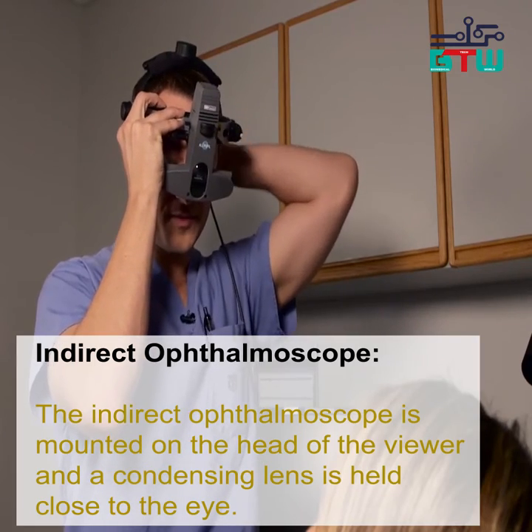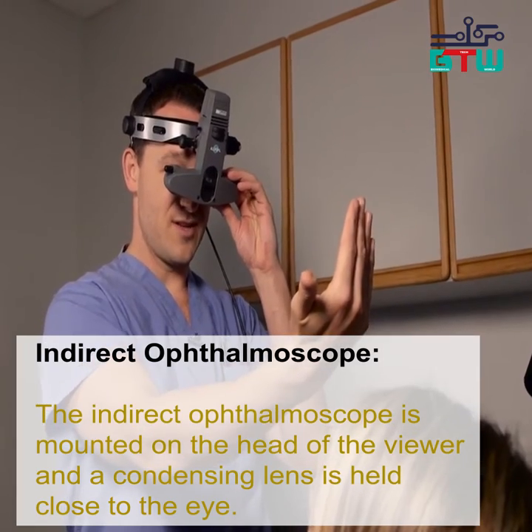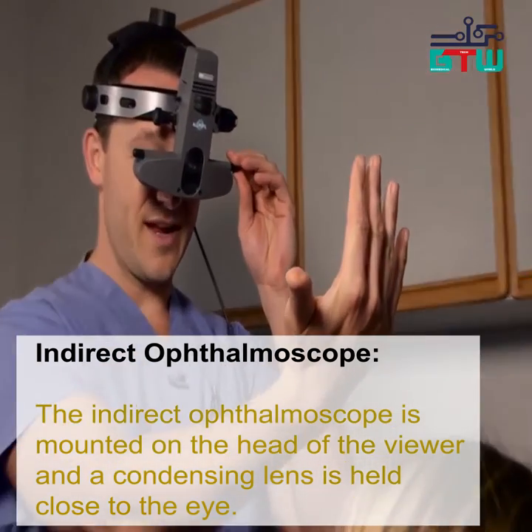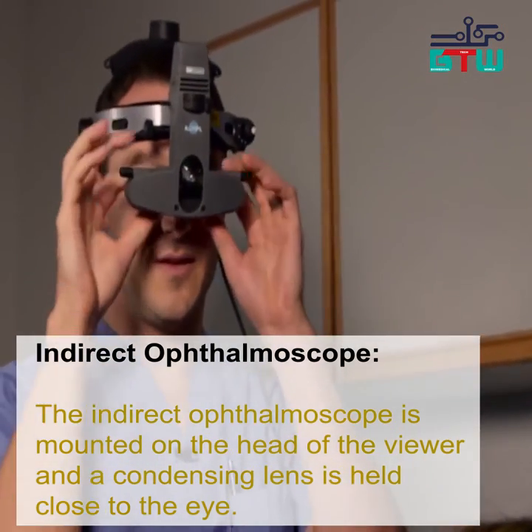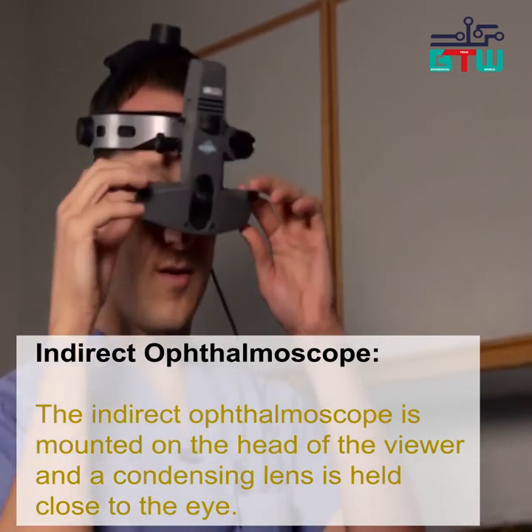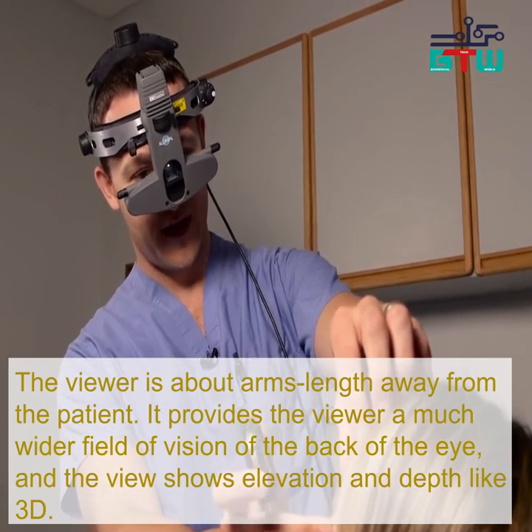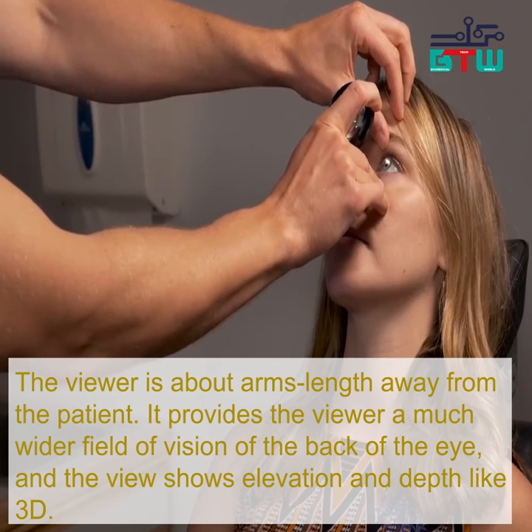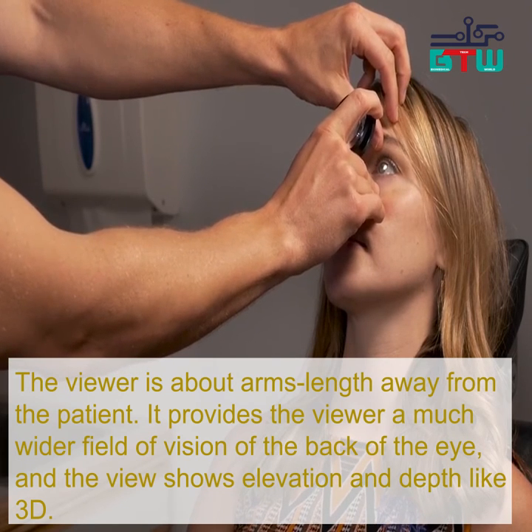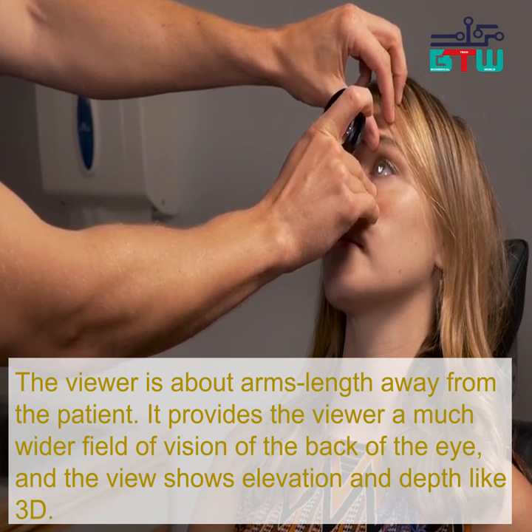The second type of ophthalmoscope is known as the indirect ophthalmoscope. The indirect ophthalmoscope is mounted on the head of the viewer, and a condensing lens is held close to the eye. The viewer is about arm's length away from the patient. It provides the viewer a much wider field of vision of the back of the eye, and the view shows elevation and depth like 3D.